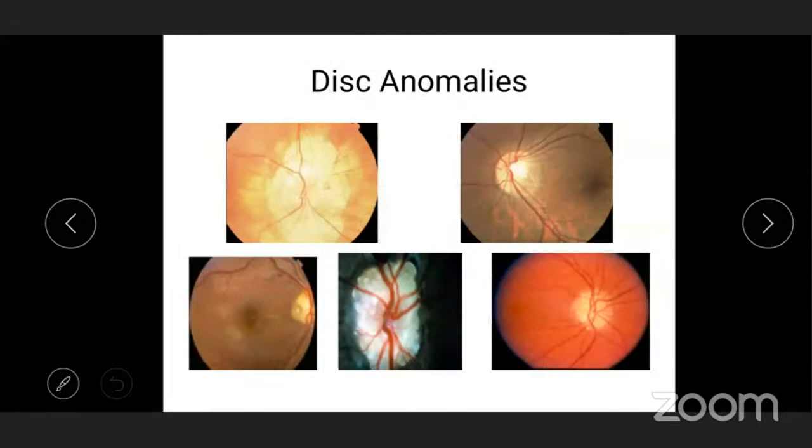If you do that, then a staphyloma. See, actually the disc margin is this one. All this is the neighboring staphyloma. So if you keep in mind the first point which I taught you, which is to look at the disc margin, then this differential, disc anomaly becomes easier to solve. Also, we have said the disc margin. See, it's like a tilted disc, and you can see a part of the disc is maldeveloped.